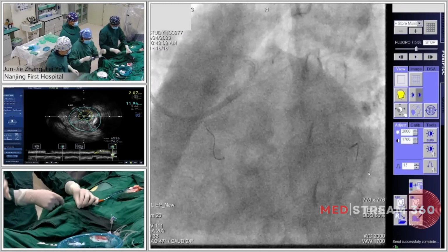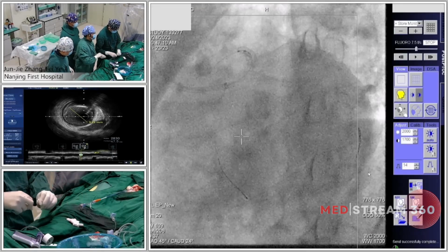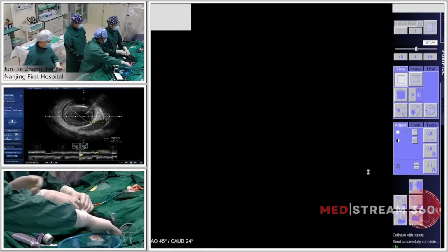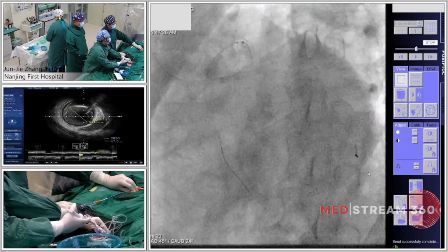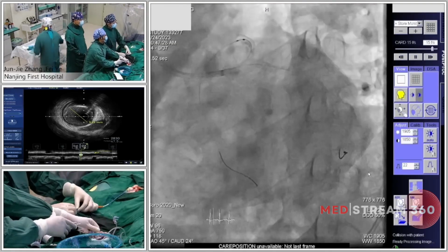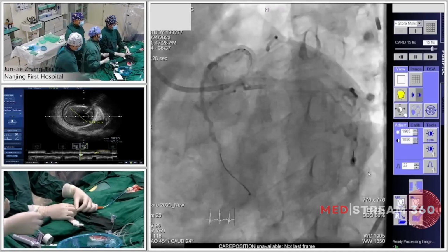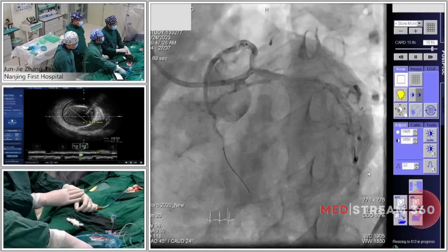we can stent. So after side branch stenting and the side branch optimization, we will do the angiogram to check there is no distal edge dissection. Then we will do the balloon crush. Okay. We can see the stent expansion. Okay, good. No dissection of the distal of the stent segment.